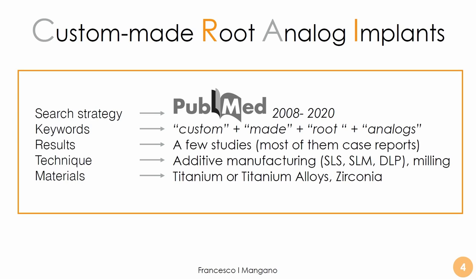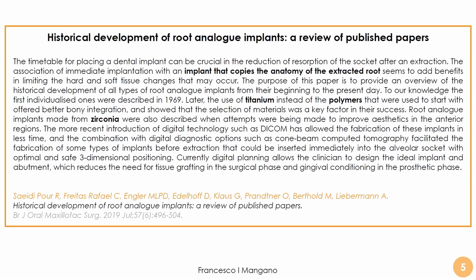If we search with these keywords in PubMed, custom-made root analog, we find a few studies. I have to say most of them are case reports on the technique that is additive manufacturing with titanium or titanium alloys. There is something also with zirconia, particularly milled zirconia, but obviously the potential for printing zirconia root analogs is even higher. But let's go through this review of the literature with the historical development of root analog implants.